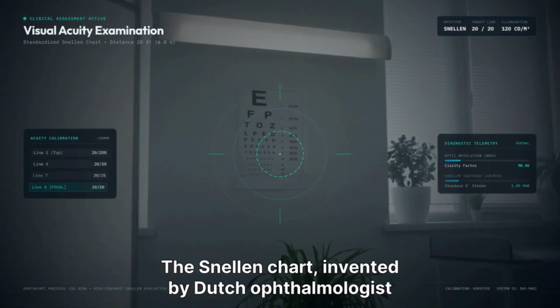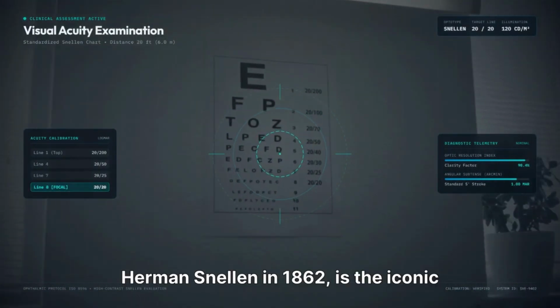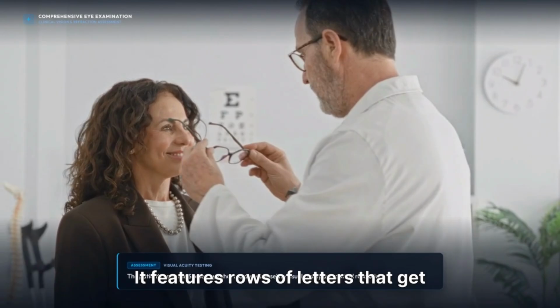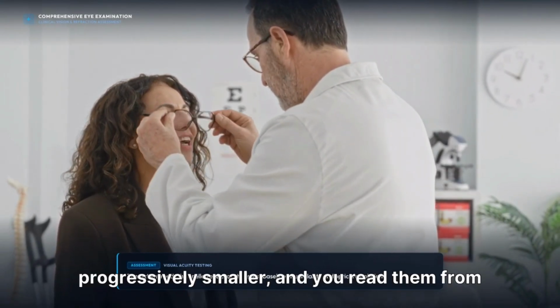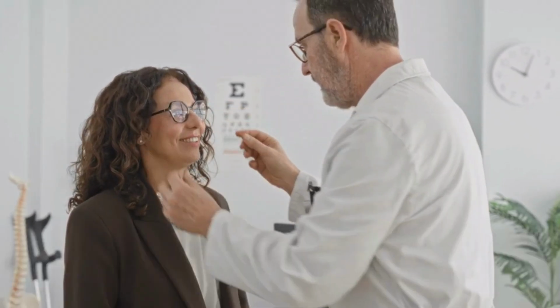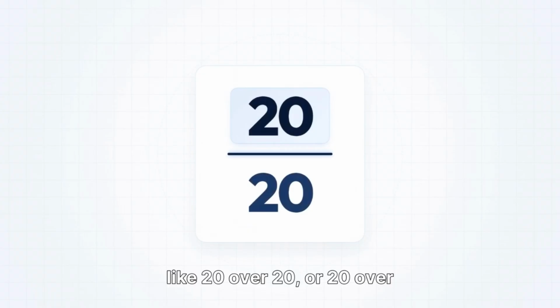The Snellen chart, invented by Dutch ophthalmologist Herman Snellen in 1862, is the iconic letter chart used in almost every eye exam. It features rows of letters that get progressively smaller, and you read them from a standard distance of 20 feet or 6 meters. The results are written as a fraction, like 20 over 20 or 20 over 200.